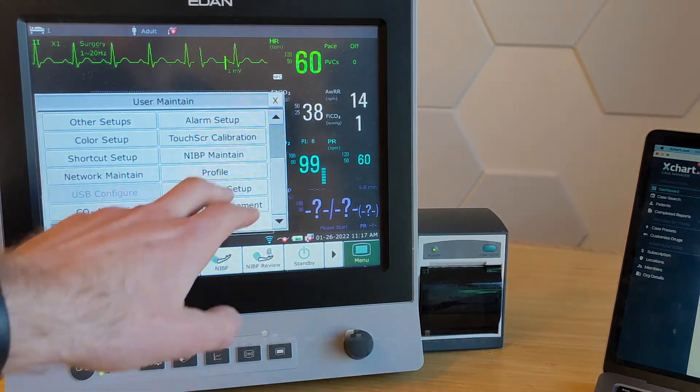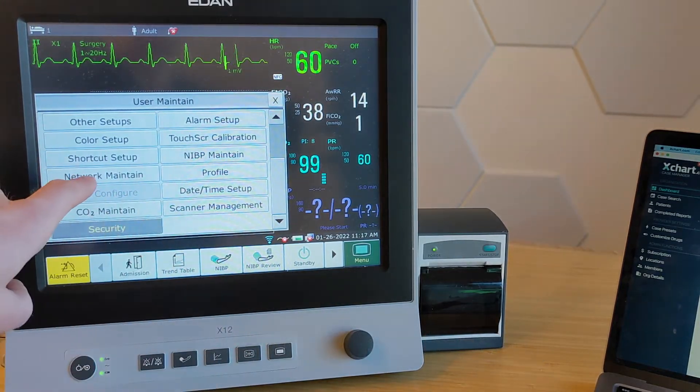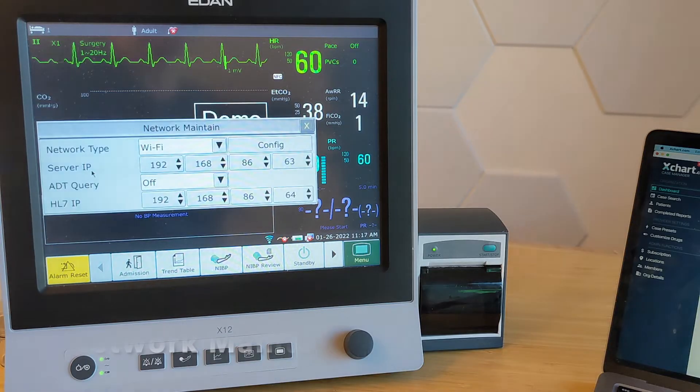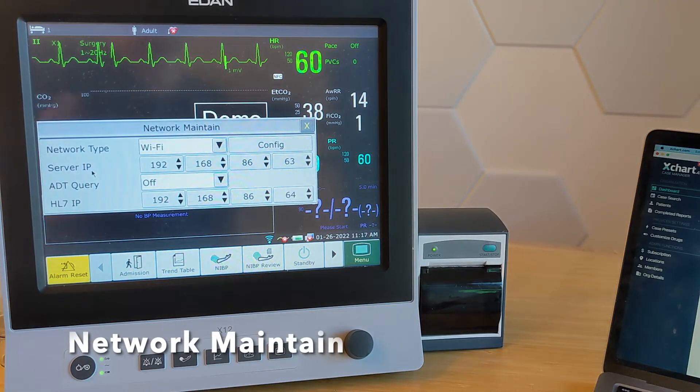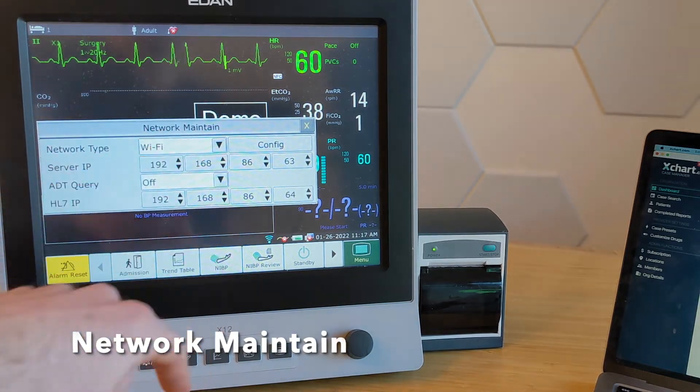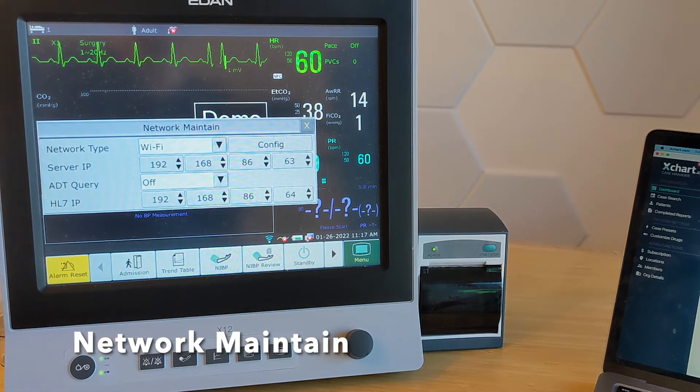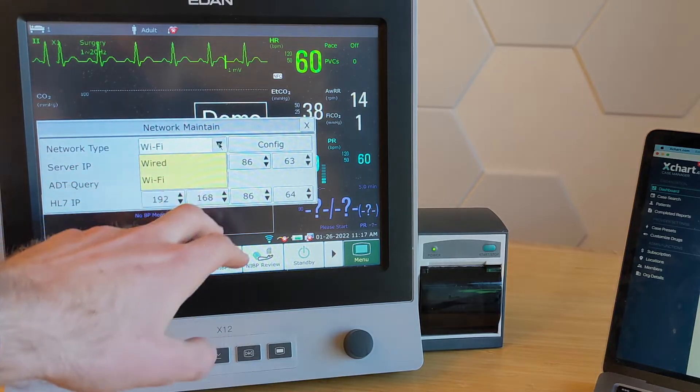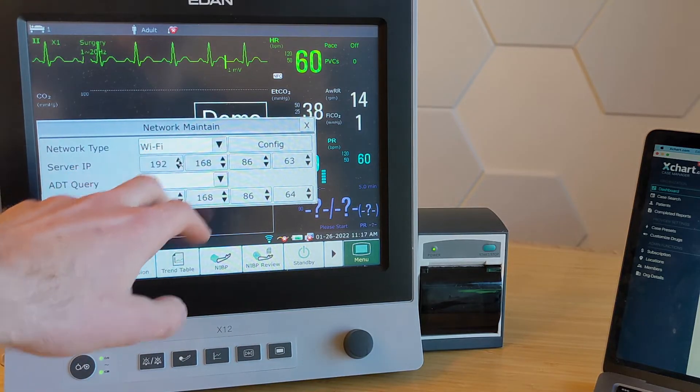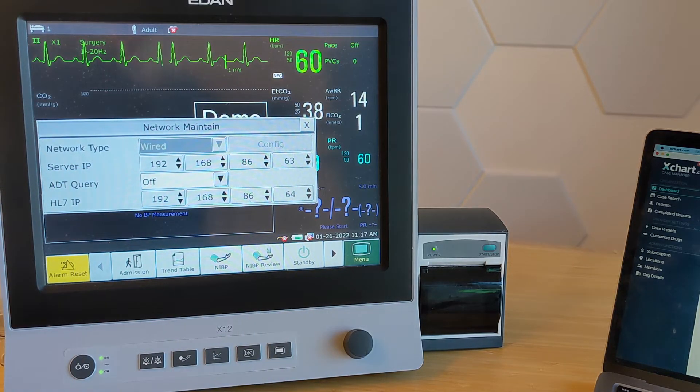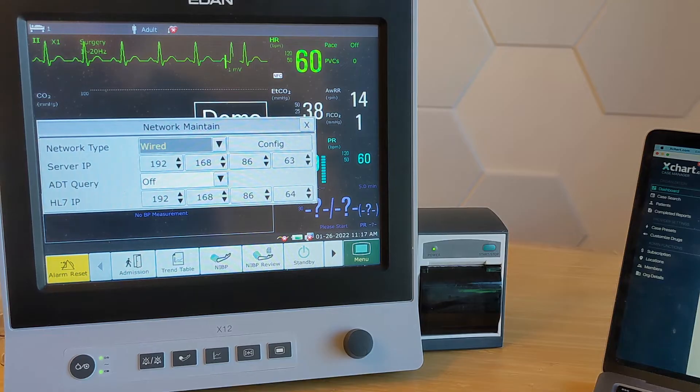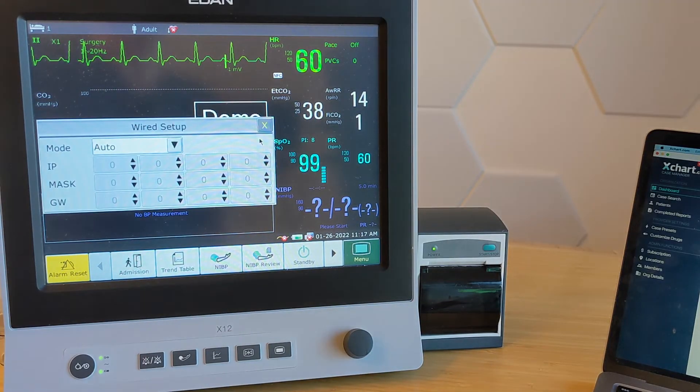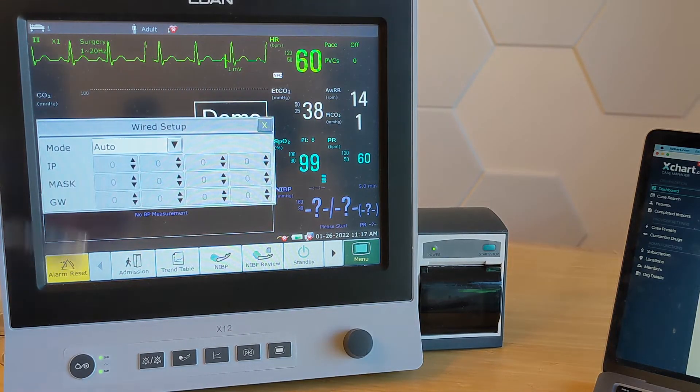The second thing we're going to want to do is we're going to go to network maintain. So here we have two options. We can either do Wi-Fi or we can do wired connection. I'm going to show you wired connection first. So if I do that, it's going to take a second. It's going to say configure.